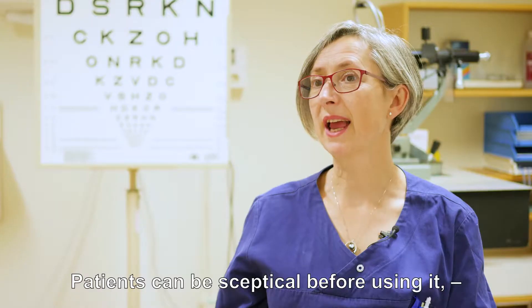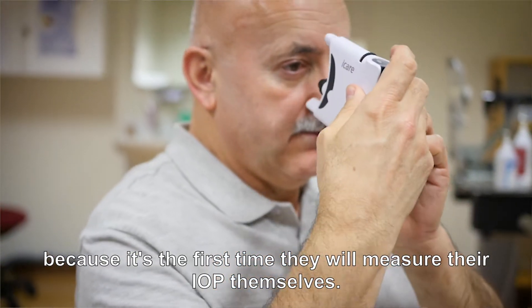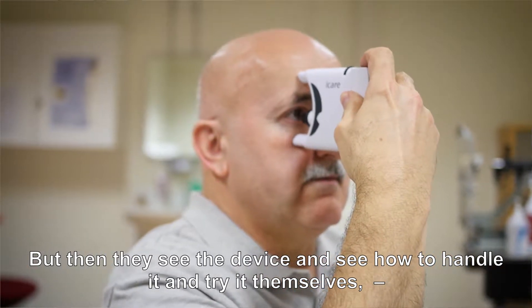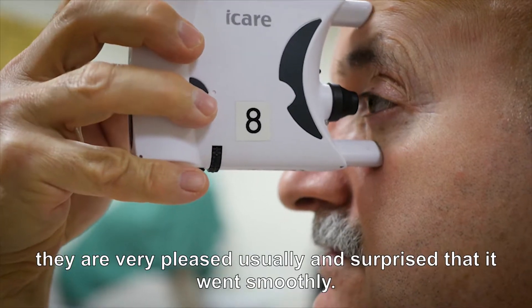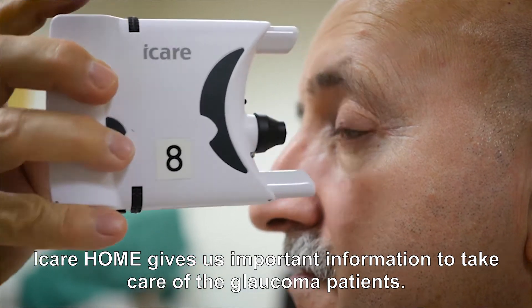Patients can be sceptical before using it because it's the first time they will measure their IOP themselves. But then when they see the device, learn how to handle it, and try it themselves, they're very pleased usually and surprised that it went so smoothly.